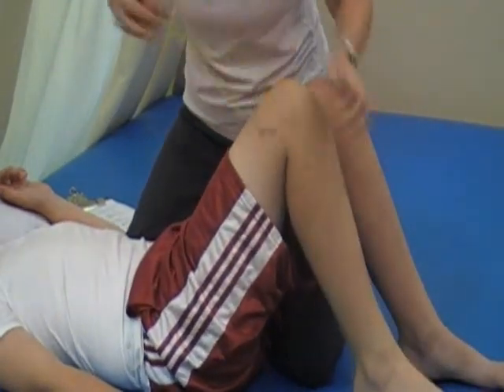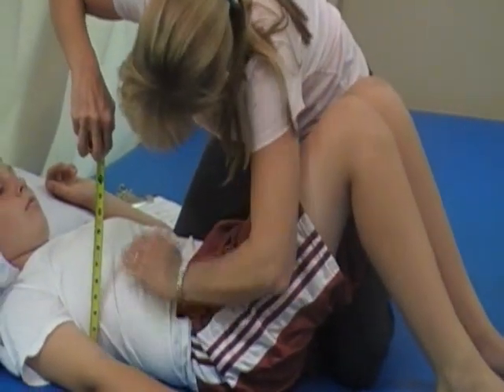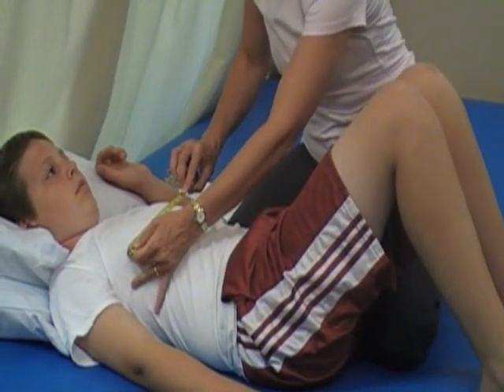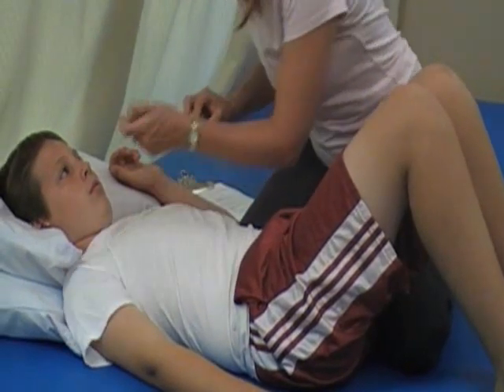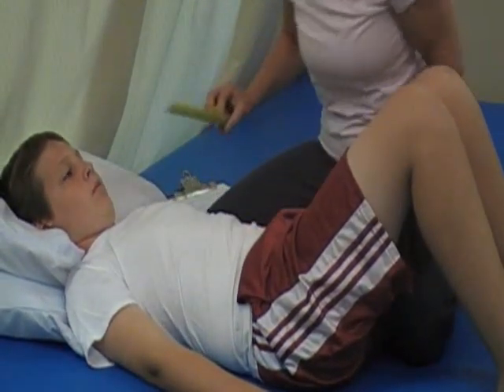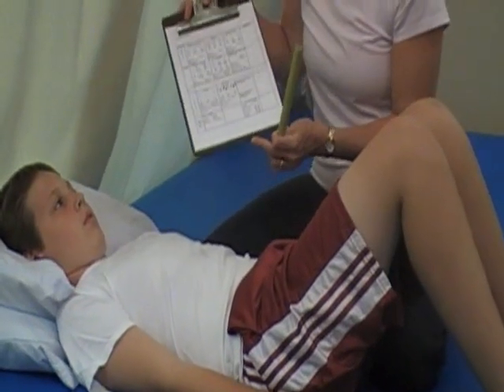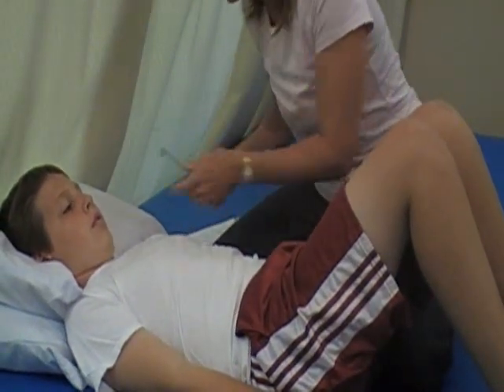The other thing you want to look at in this position is chest depth, chest width. Chest width is B, and shoulder width. Again, it's really helpful to have your form and to have somebody else helping you with taking measurements.